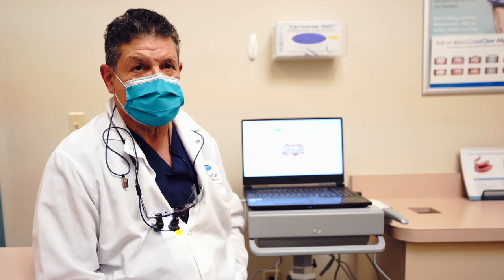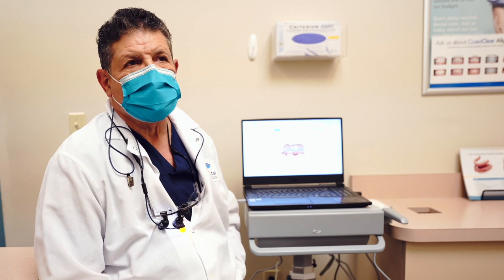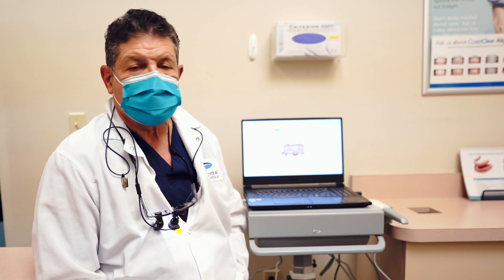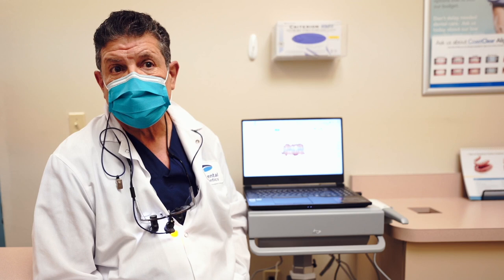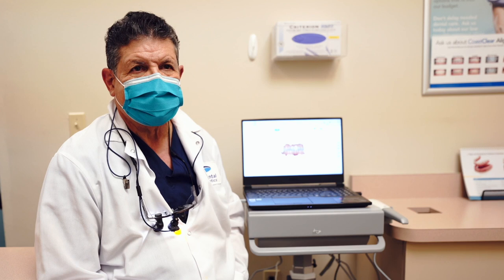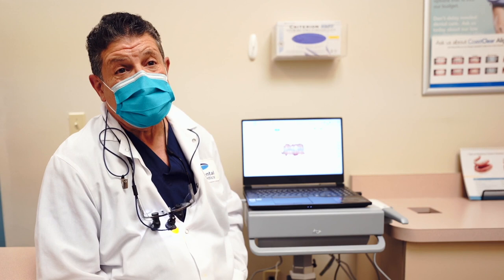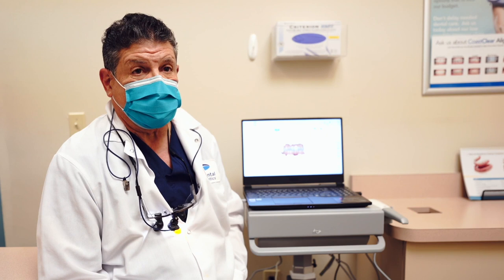We use the IntelliScan for crown preparation, bridge preparation, clear aligner therapy, the newer periodontal products, dentures, and partials. One thing that I've noticed is that by using it to seat a crown that might be an abutment tooth for a partial, it's making those partials fit beautifully. I recommend that anyone who wants to produce dentistry that fits well and is accurate use IntelliScan. There is absolutely no downside to scanning versus using impression material.